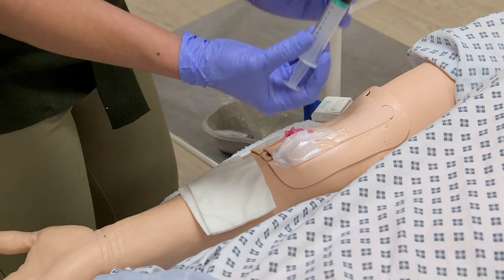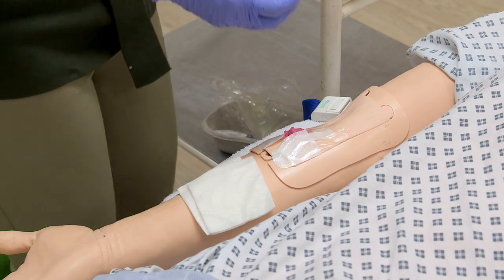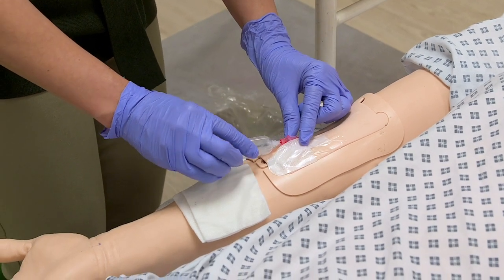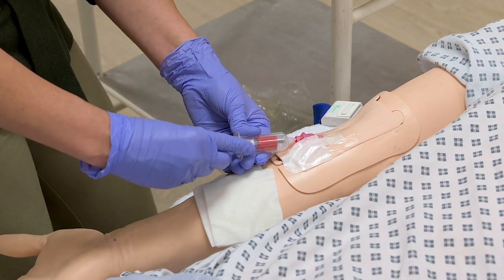This is one method. In the second method, we have to use the blood of the patient. In this case, we have to use the blood of the patient.